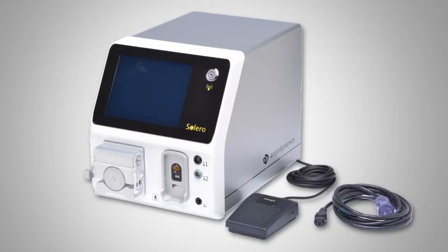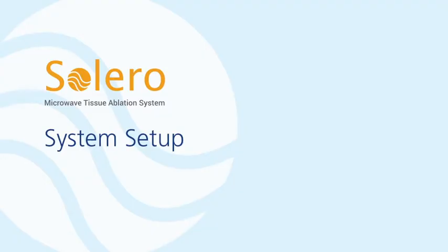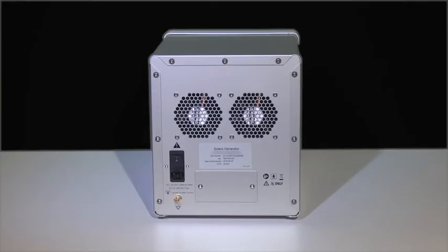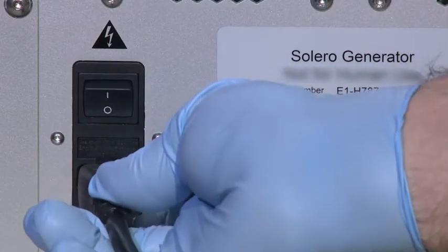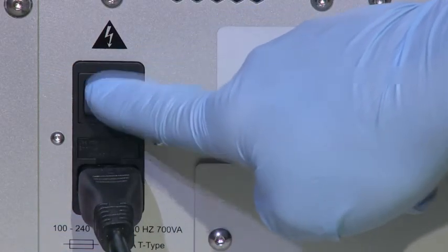The system also includes the optional foot switch and the mains power cable. To begin system setup, start by connecting the mains power cable to the back of the generator.